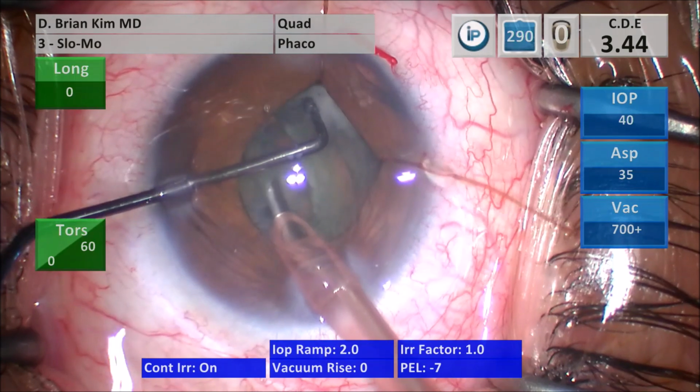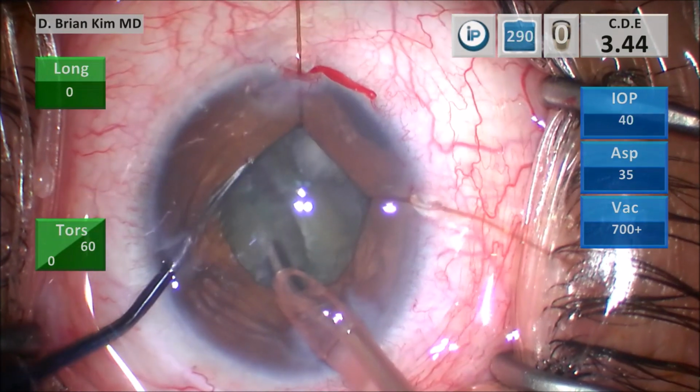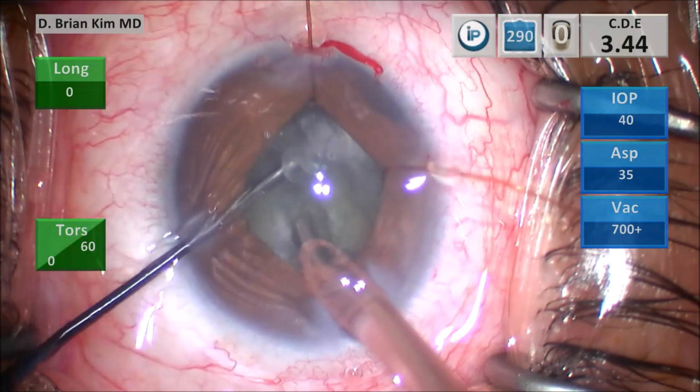This is the terminal chop technique, placing the chopper around the contra-incisional equatorial lens material and fracturing the lens from that side. Now I have two separate pieces.